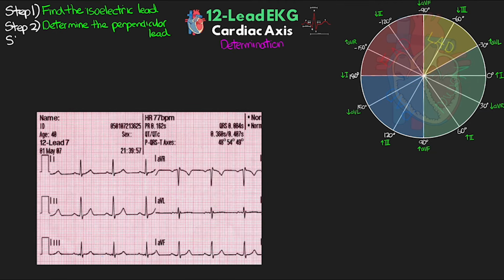Alright, for step 3, now that we know the perpendicular lead, we need to determine is the waveform in that lead positive or negative.